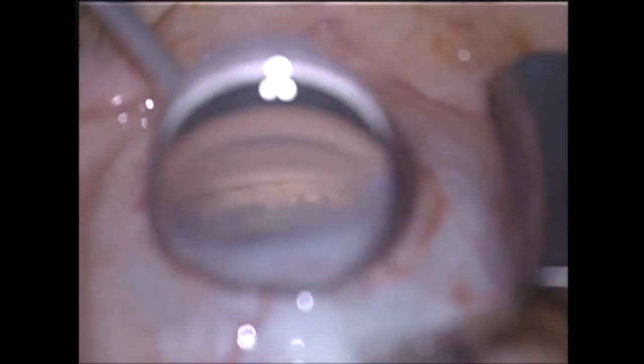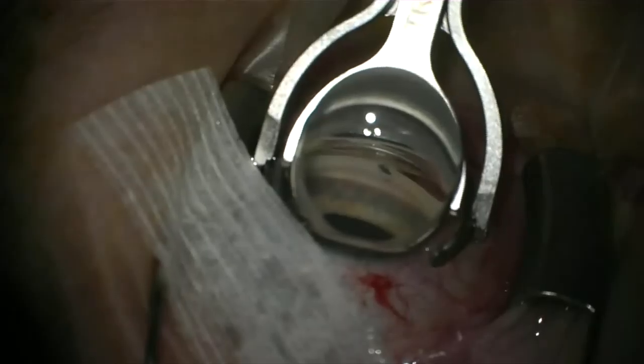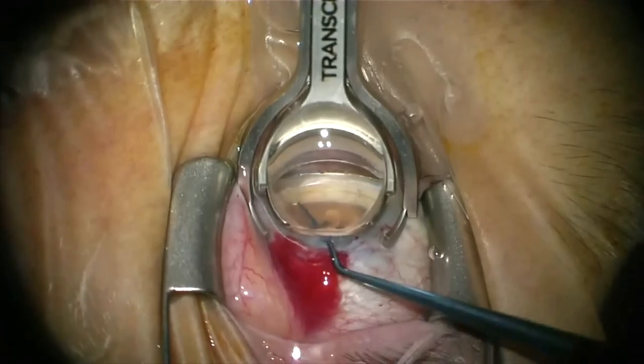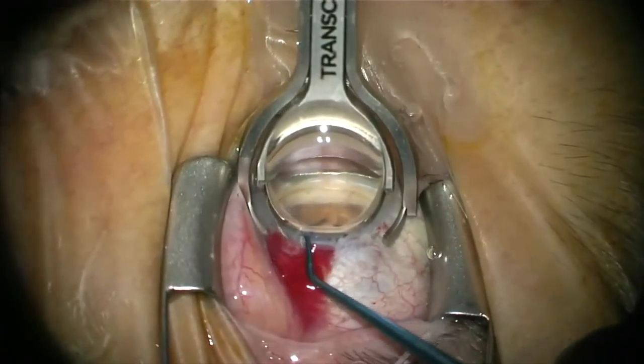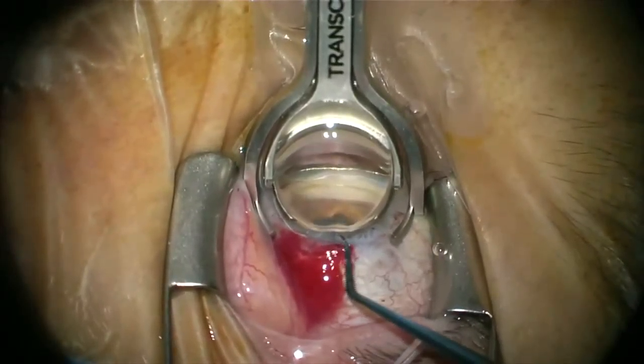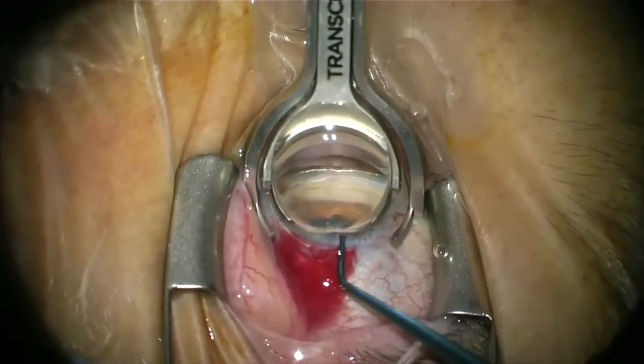Adjust the magnification and brightness to view the angle structures. One can fine-tune angle viewing by having the patient look nasally. The corneal incision can act as a pivot point and anchor for instruments during surgical manipulation. If the wound is covered by the gonio lens, one can displace it with the VOLD lens to access the anterior chamber. Post-op goniophotography provides a means for strengthening the doctor-patient relationship by demonstrating surgical outcomes as well as counseling surgical candidates who are considering angle surgery.